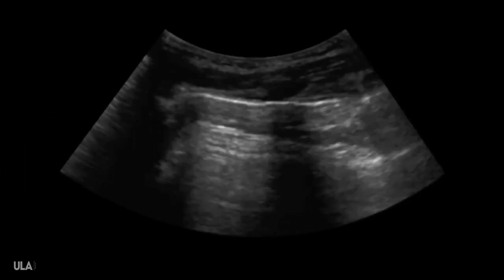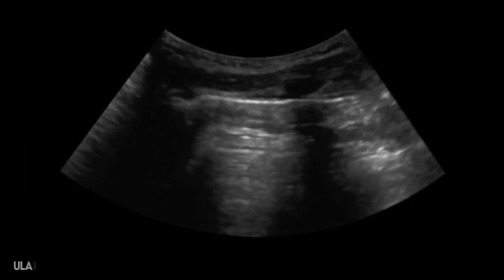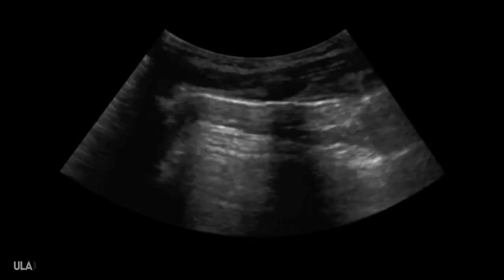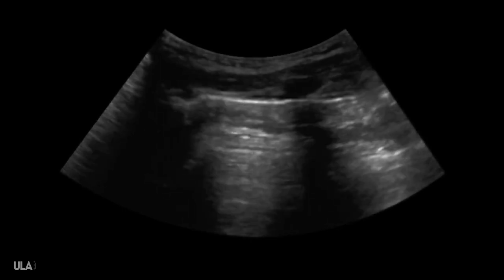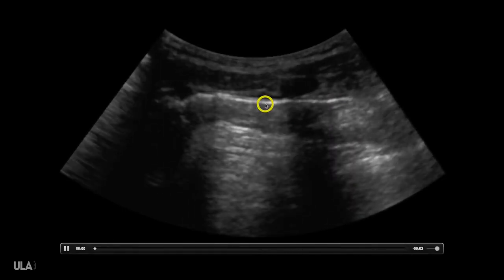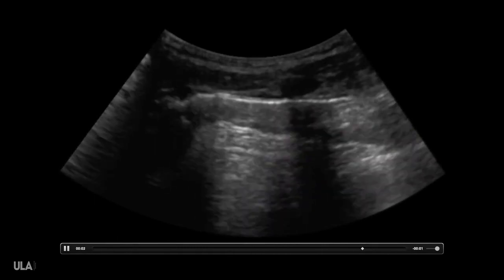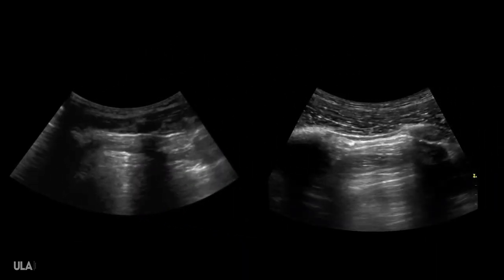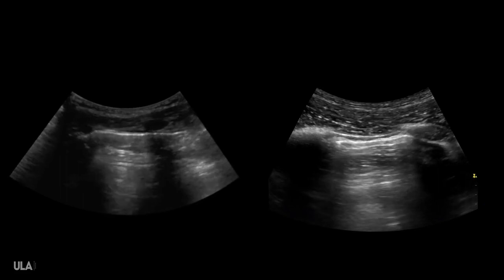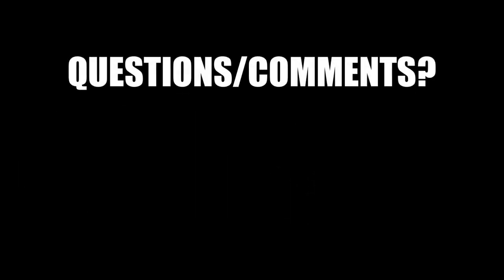Here's an actual pneumothorax seen with a curvilinear transducer in an actual trauma patient. You can see here we have that pleural line up here. I don't really see any lateral movement. Let's compare that to the curvilinear transducer with good lung sliding — you can see, very easy to tell the difference.